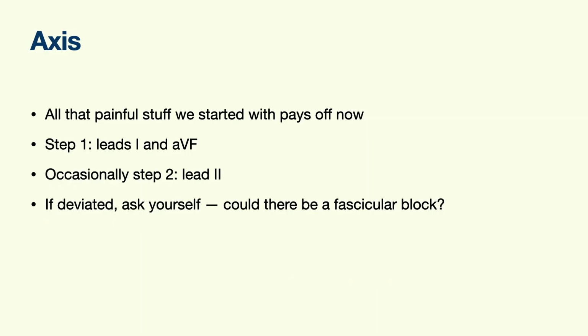trigger and your diagnostic schema to ask yourself or wonder whether there might be a fascicular block. Fascicular blocks may or may not be important to recognize for the most part, but if you're someone who cares deeply about ECG, first of all, it can be some evidence of conducting system disease, and so that might help your diagnostic schema. Someone comes in with syncope, things like that.